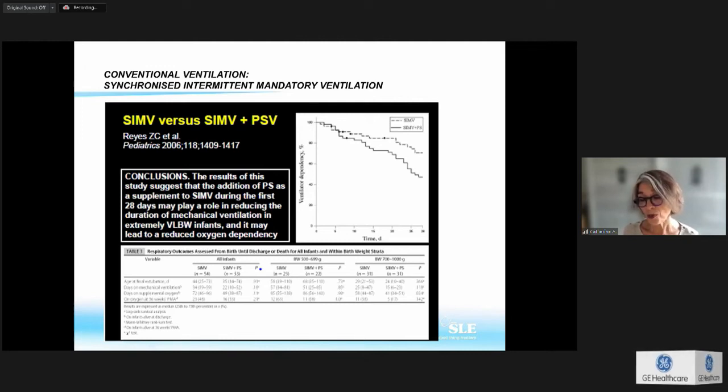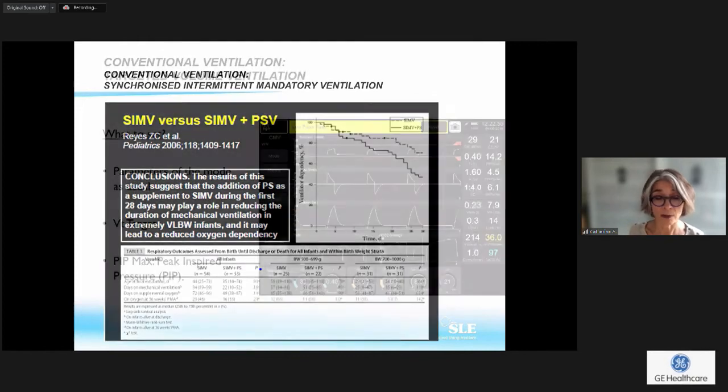I think that pressure support and PTV are some modes that you can use right from the beginning to extubation. Don't always think of SIMV, which we see widely used. Why give a big breath at one time, a small breath at another time? If you want to train your patients, if you want to see if your patient is fit enough to breathe, just go to PTV, decrease your PIP, and see what is happening. Is your patient able to generate a proper tidal volume? Okay, so it means that he has to make more effort. Can you wean your patient even more? That is a question that you will be asking.